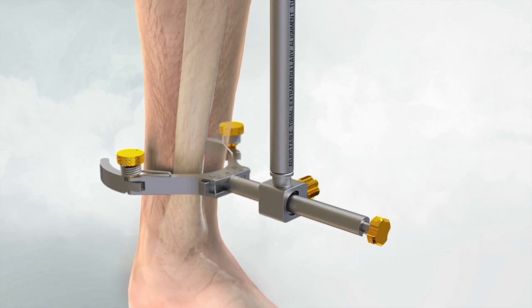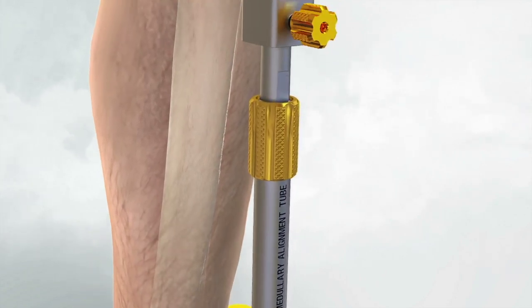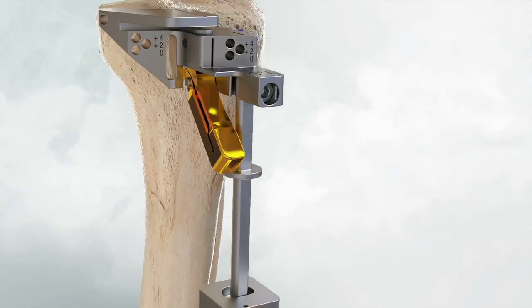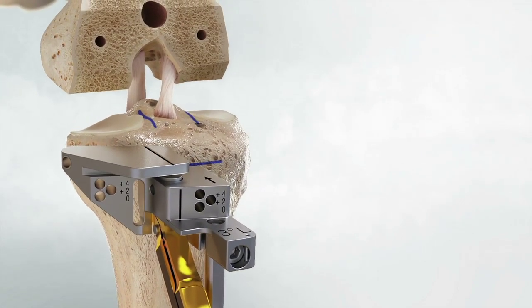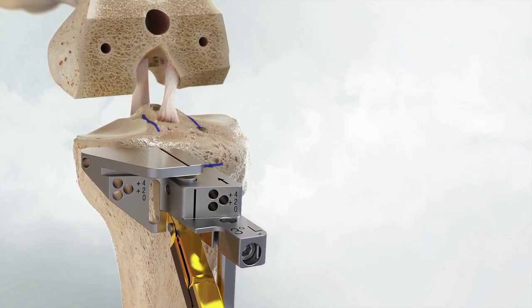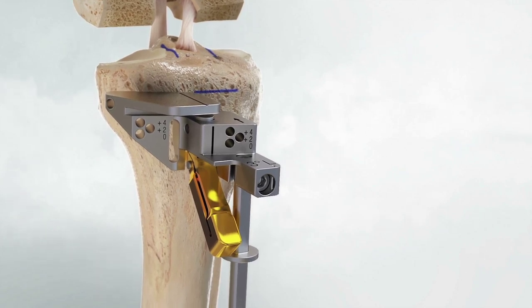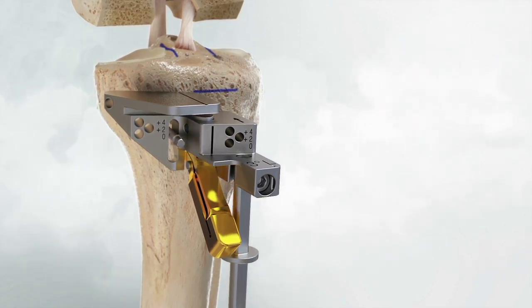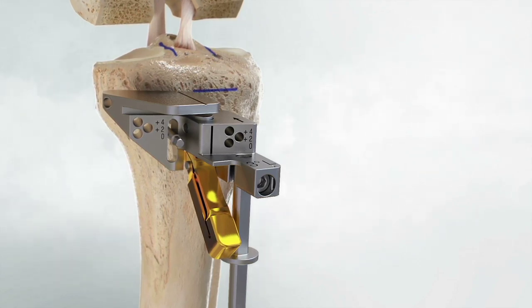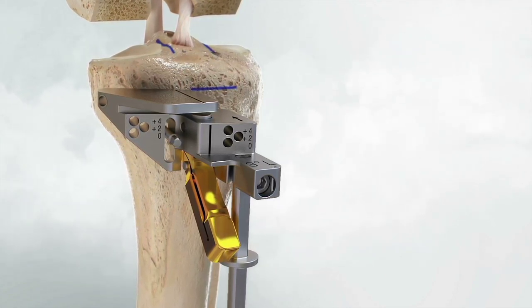Place the arms of the extramedullary alignment clamp around the ankle and adjust the distal medial-lateral slide directly over the middle of the tibiotalar joint, approximated by the second ray of the foot proximal to the malleoli. Mate the datum block to the anterior tibia by making the groove roughly in line with the medial marking from the tibial sizing template to ensure the block is not too lateral. Align the top of the datum block with the provisional depth mark from the distal femoral gauge and place a 65 mm headed speed pin through the upper half of the datum block's provisional slot to stabilize. Do not fully seat the pin, as the distal femoral gauge marking tends to overestimate the tibial resection if the knee is hyperextended in the distal cut step.